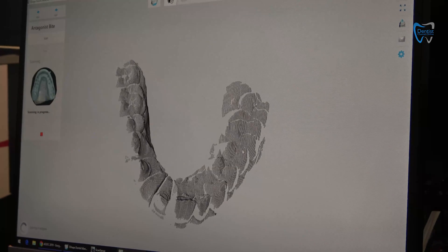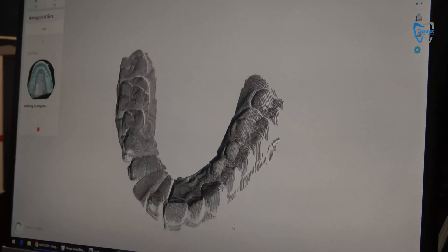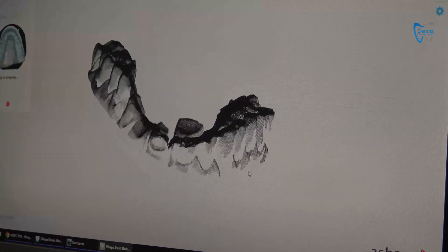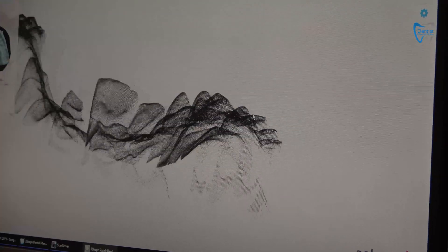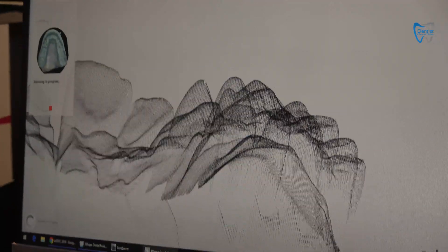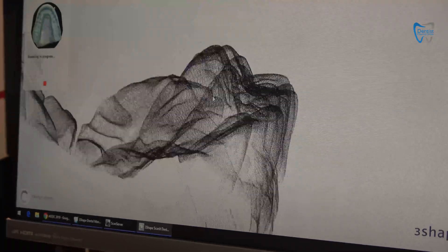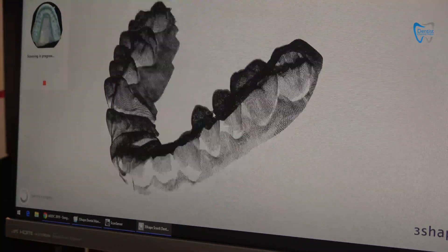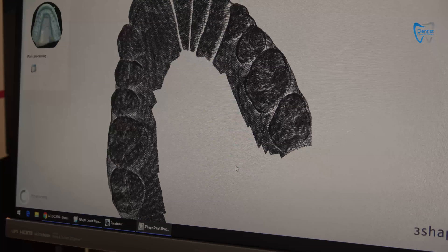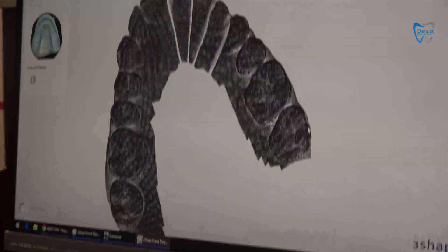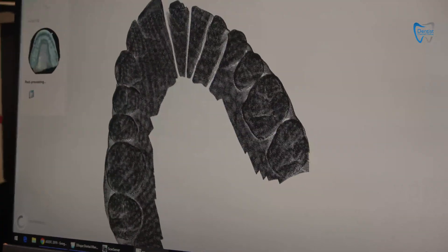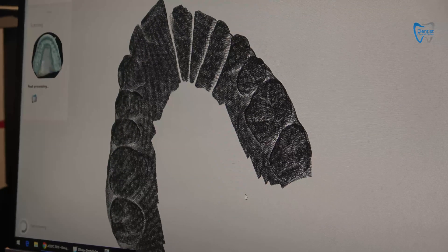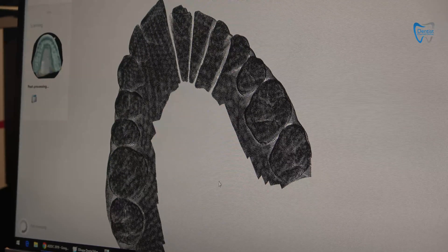Right now you see point cloud, which is quite dense, and it's great coverage. Without any artificial points, the coverage is really good. You can also import information. Scanning is finished, and right now post-processing starts. It means that hardware calculates the surface, creating the surface.